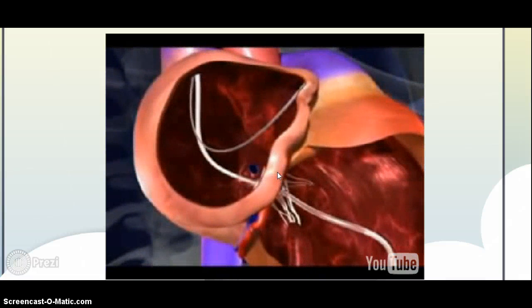a second wire is introduced into the right atrium of the heart, which is the top chamber seen in the animation.